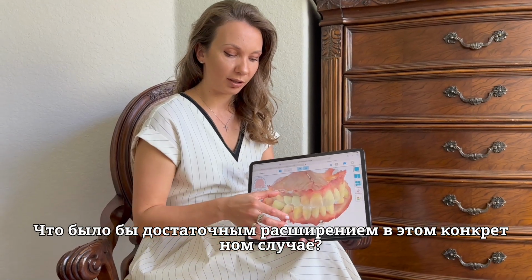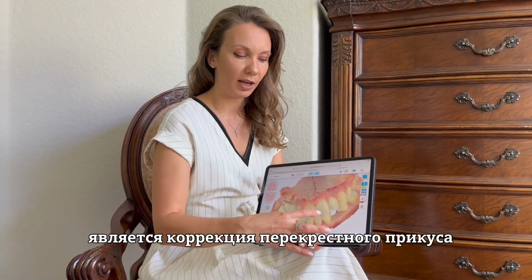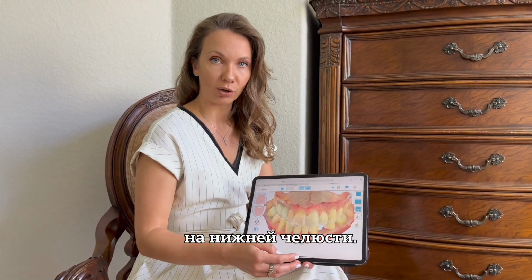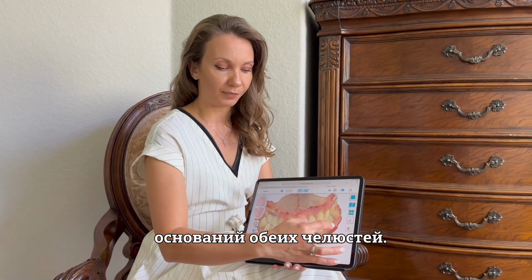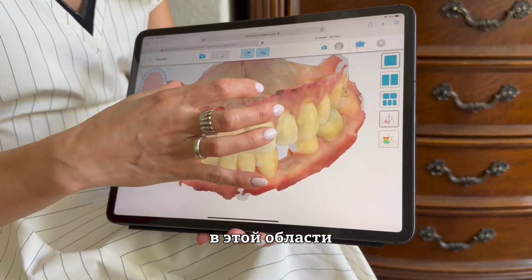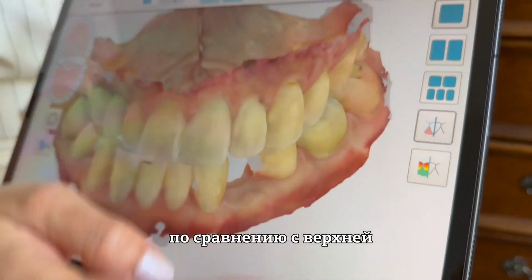What would be enough expansion in this particular case? First of all, our most important goal is to correct this crossbite on either side, and going with the skeletal expansion will cause expansion on both sides, so that has to be accommodated on the lower jaw as well. Second thing, how far should we go? First, we're looking at the width of the bases of both jaws. So the width of the actual bone embracing the teeth here in these areas and in the posterior molar areas. How wider is the lower bone compared to the upper bone?